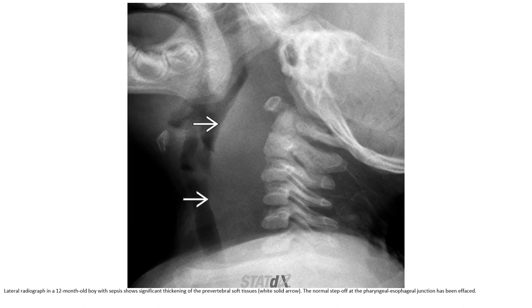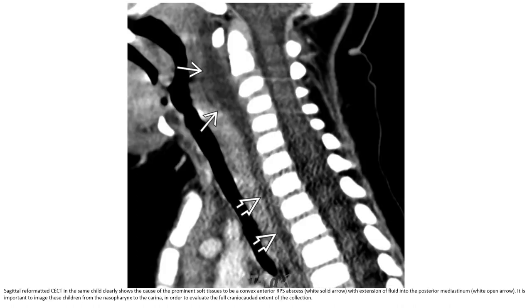This is a 12-month-old patient. There is significant widening of the prevertebral soft tissue. The normal stepwise configuration at the pharyngeal-esophageal junction is lost. This is a case of retropharyngeal space abscess.